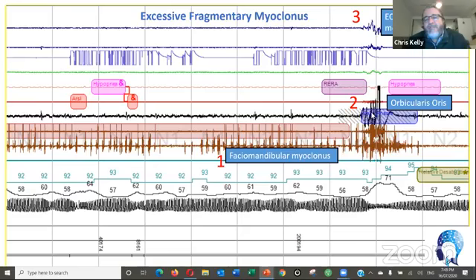And this person is clenching, but what are they clenching on? My guess is they're clenching on their front teeth and crushing their disc at the same time, which is why they've got the TMD. You see that pulsatile increase there as you get to the actual bruxism. Through the whole thing, there's no great pulsatile increase.